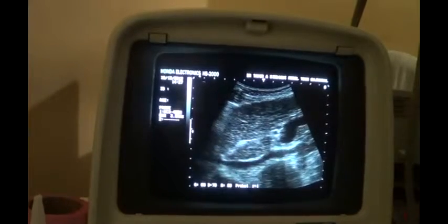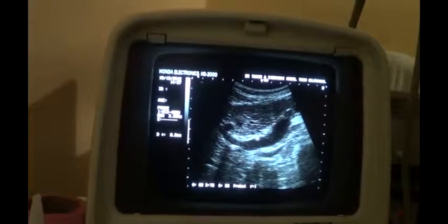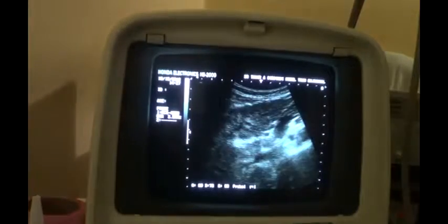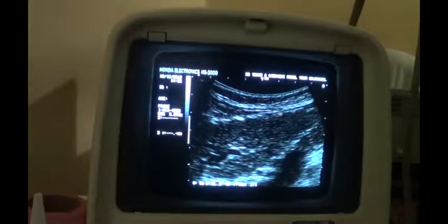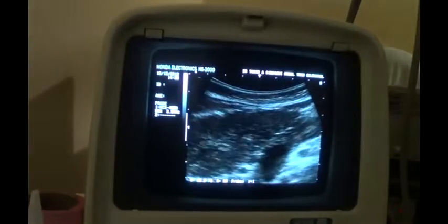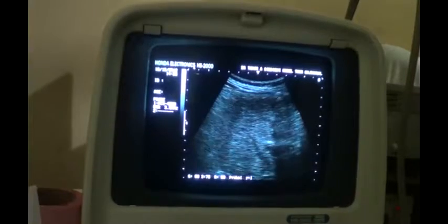So this is an advanced stage cirrhotic liver with portal vein measuring at the level of porta hepatis from inner to inner about 10.2 millimeters, normal is up to 13. See the degree of irregularity of the outer surface. This is the outer surface of the liver, this area. See the irregularity of the outer surface throughout the liver currently. All of the liver shows the same.